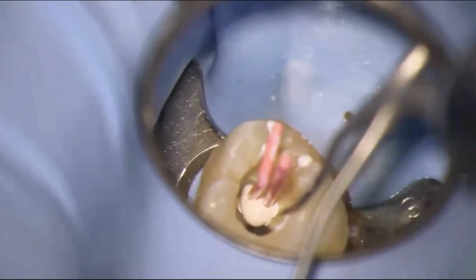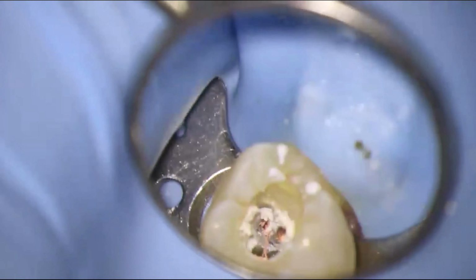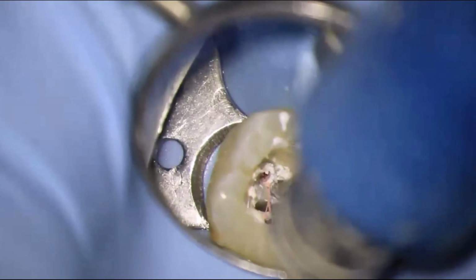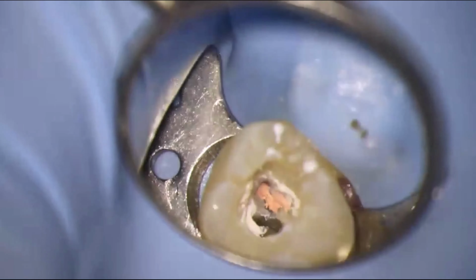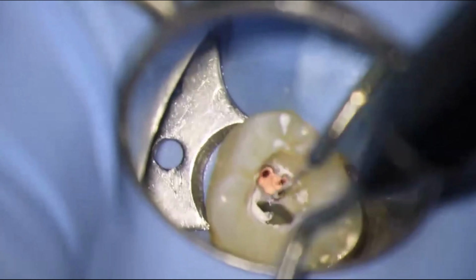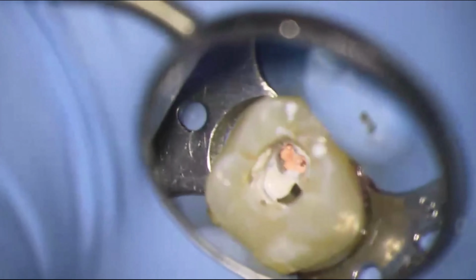Now we're going to sear these. Okay, and then we're going to use the warm gutta percha. We're going to seat the obturator needle here, and I'm going to use that as a plugger, and I'm going to use the warm gutta percha as a compactor. We're going to put a ton of pressure on this now, and it's going to move that whole massive sealer everywhere. Okay, it's not super clean. It's going to look a little messy. We're going to clean that up later.